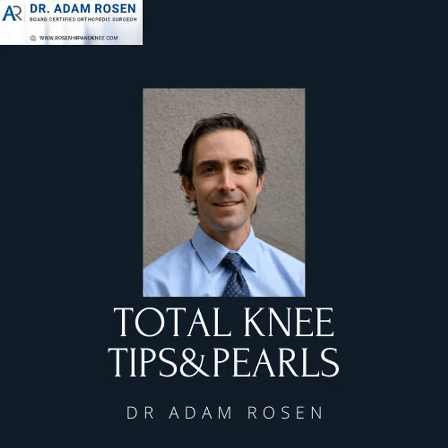Now, just a little aside, backing up, as somebody might be thinking at this point, well, what about, did you aspirate or take cultures? Okay, so if I know they're infected, I will probably already know that, because if I suspect that someone's infected in the office or in the hospital, I've already sent off fluid, but I will take additional fluid and tissue cultures at the time. The reason that I do that is I like to know going in if they have an infection, or I suspect they have an infection. I like to know, do they or do they not?